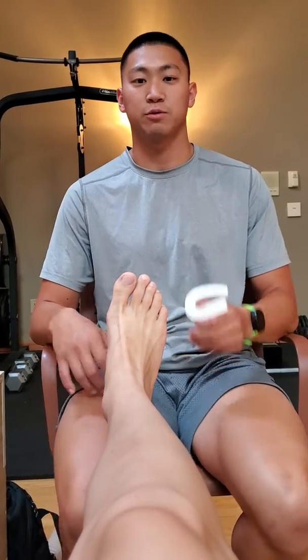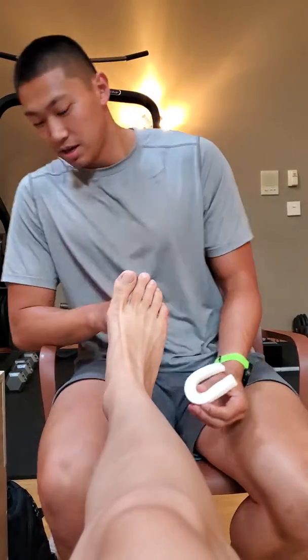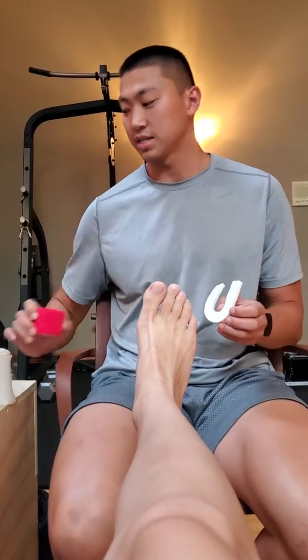This is Andrew Nesbitt. Today I'm going to be going over how to tape a horseshoe pad to a client that has ankle edema. I'm going to be using this rubber horseshoe pad, 4 inch bandage tape, and this red stretchy elastic tape.